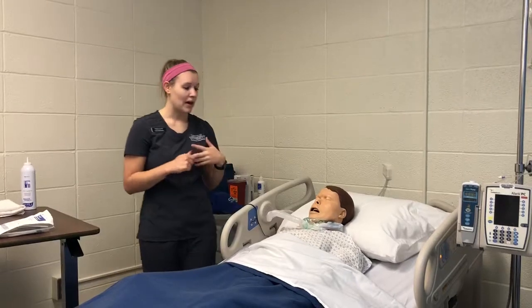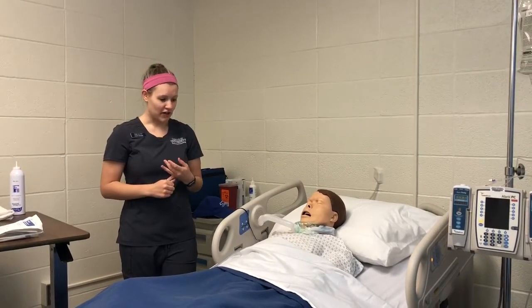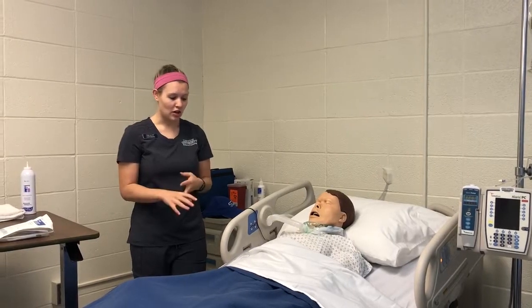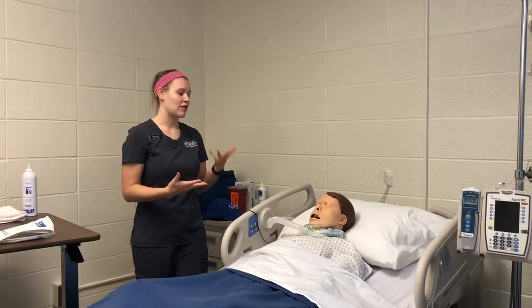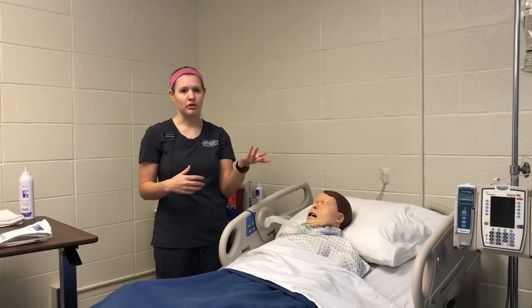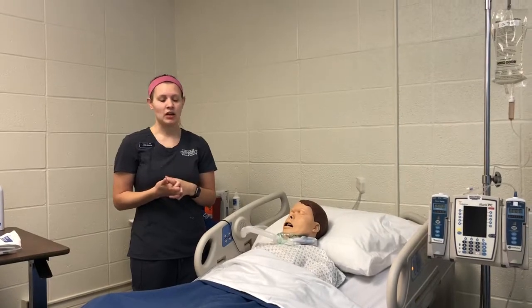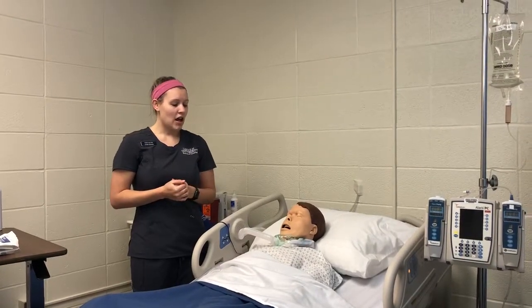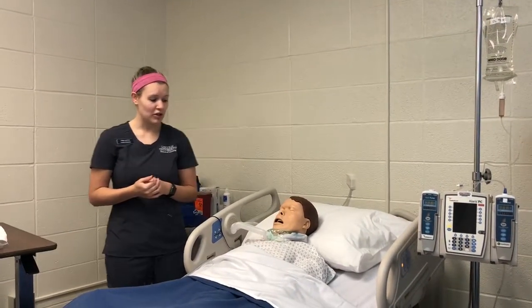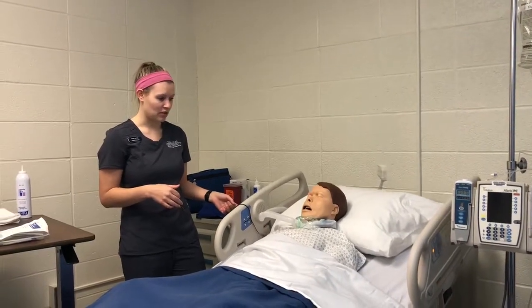So I would want to identify the patient with two patient identifiers. I could use their armband. They may not be able to communicate very well. I could also use their MAR to compare the armband to a family member in the room. Have the patient nod if I repeated their name and date of birth or anything like that. I also want to make sure that my patient is in a high Fowler's position whenever we're doing this.